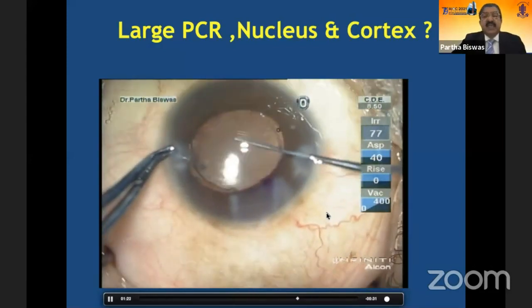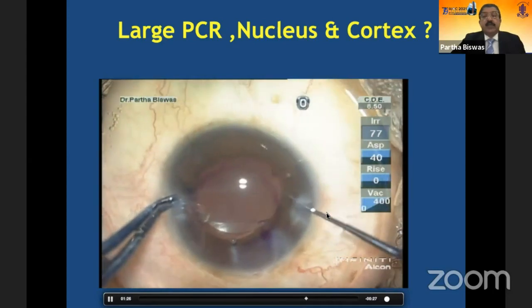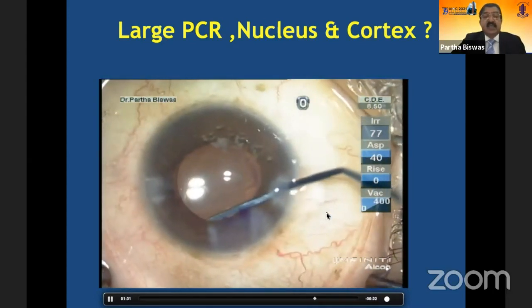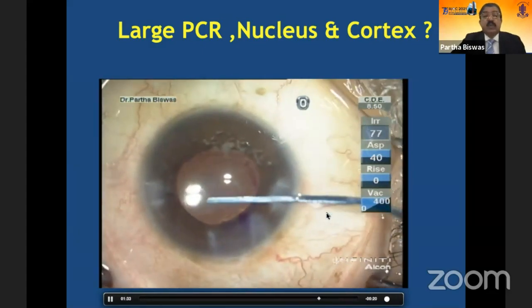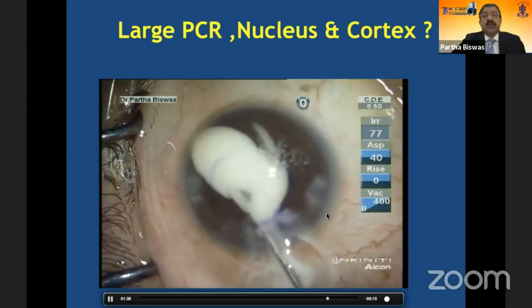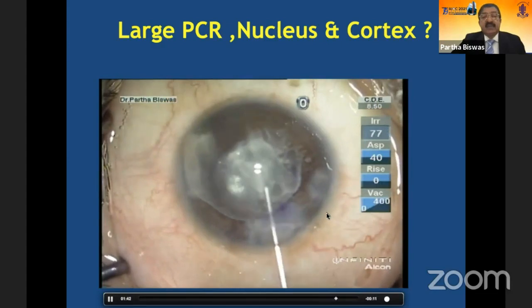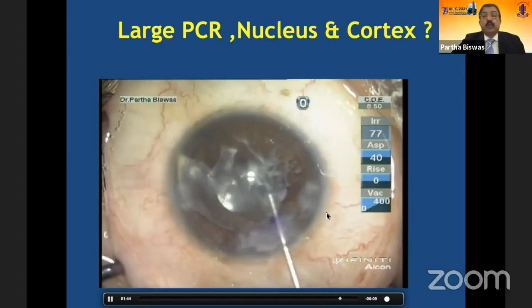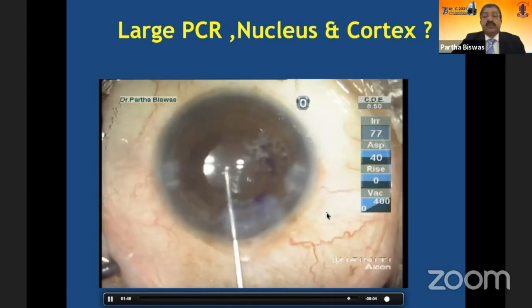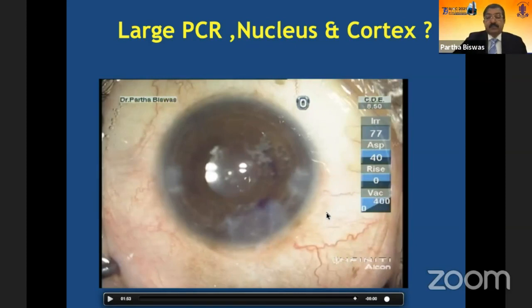So we place the intraocular lens in the sulcus and put it in place. Here you can see there is an amount of vitreous which is not so visible from outside. Therefore, you need to put triamcinolone. You need to see whether there is vitreous in the anterior chamber, and this should be a rule before you close up the case. If there is vitreous in the anterior chamber, you need to do a vitrectomy, nicely cleaning up, which is not so difficult at all.